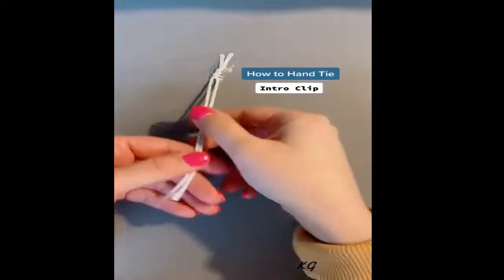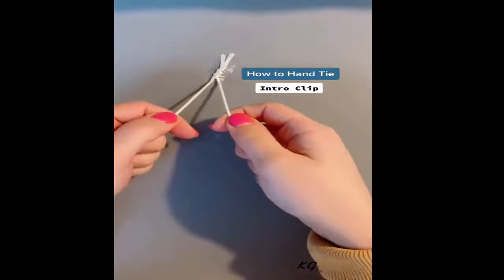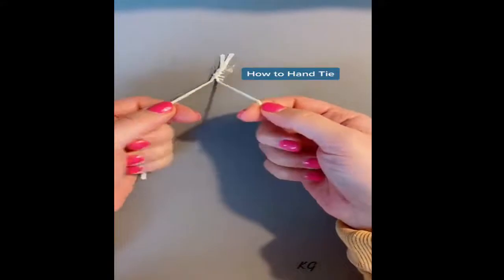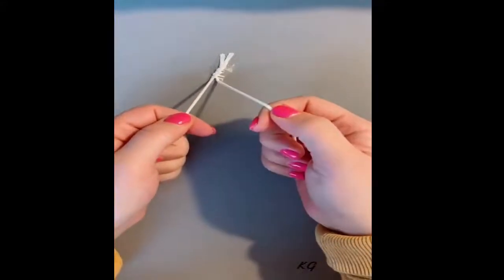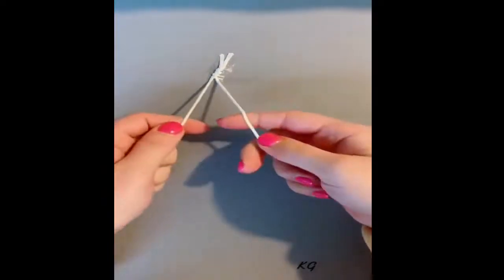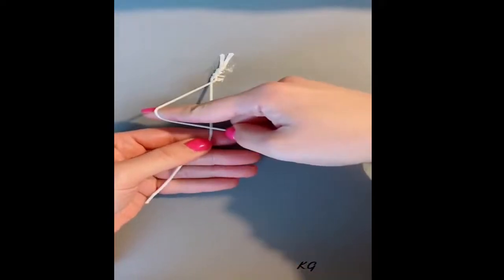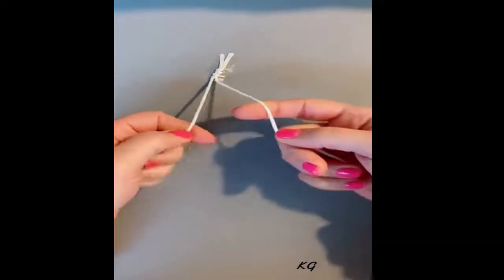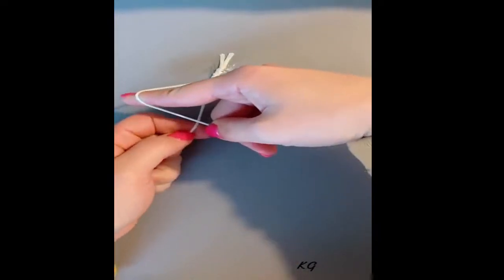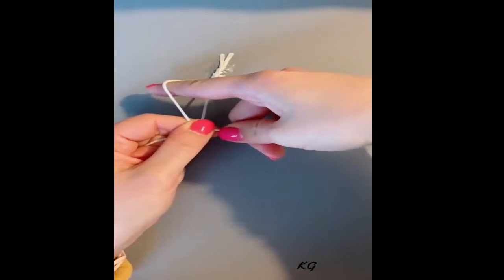Hey y'all, let's go over how to hand tie today. The way I like to hold my suture is like I'm holding the reins of a horse. When you ride a horse, you just want to hold onto the suture like the reins there. You want the thumbs on top, and then you want to take your dominant hand—that for me is my right hand—and create a figure four with your index finger, just like that. Then with your non-dominant hand, so for me that's my left hand, I use my left thumb and I pinch down that area where the suture intersects.